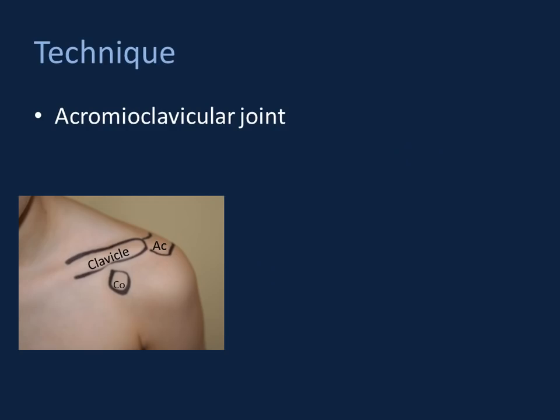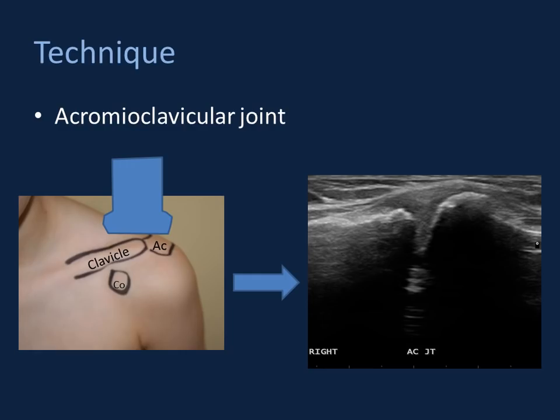Let's go on to the sonographic evaluation. We'll start with the acromioclavicular joint. In this drawing, I've stenciled in those acoustic impediments on my son — non-toxic ink was utilized, no children were harmed. You can see the clavicle, acromion, and coracoid process in roughly their position on the patient. We start by placing our probe in a dorsal orientation. A representative image will show normal smooth margins of both the clavicle and the acromion, and a relatively uniform thickness and echogenicity of the dorsal acromioclavicular joint capsule.